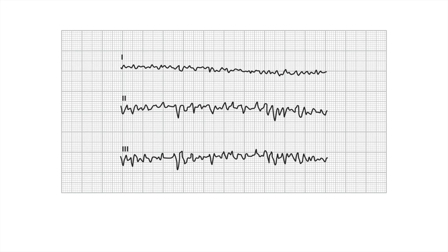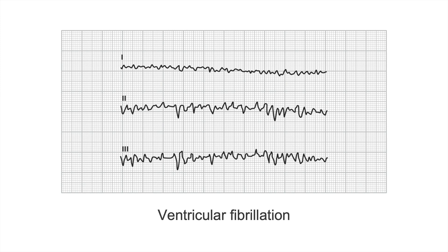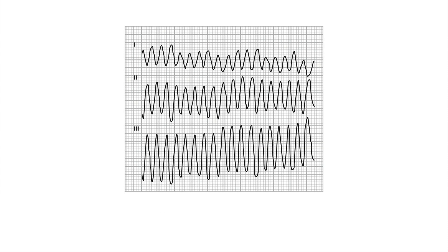Here you can see bizarre-shaped and irregular spikes up to one millivolt in amplitude. You should try to memorize this characteristic tracing and be able to recognize it immediately. It's a case of ventricular fibrillation. In this instance, the ventricles don't contract properly and the patient is in circulatory arrest. Without proper resuscitation and defibrillation, this patient will die. So always remember ventricular fibrillation, which is a truly dangerous and life-threatening entity.